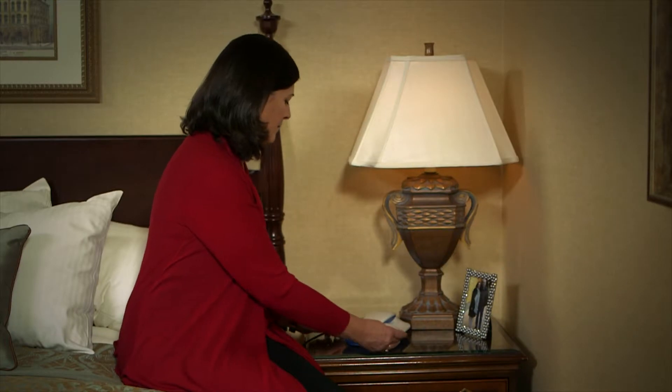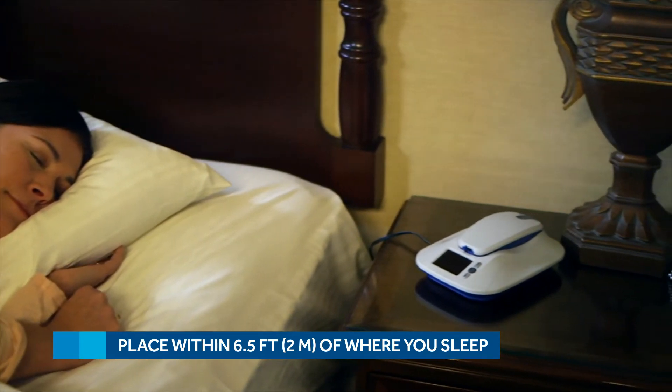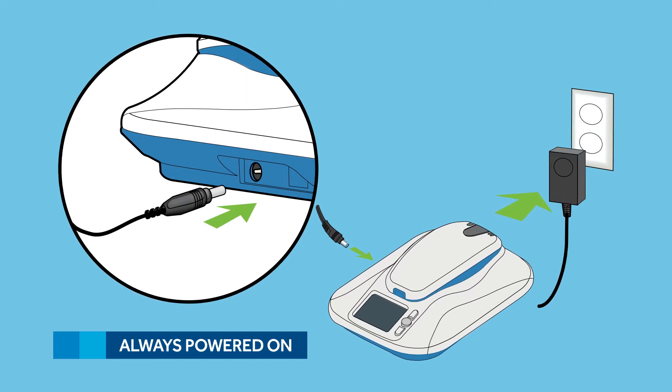First, find a good place to keep the MyCareLink monitor. It should be placed within six and a half feet or two meters of your bed. This is because your doctor will program your RevealLink device to send information to the MyCareLink monitor at a time you're usually sleeping. Plug it into a standard power outlet, and make sure it's one that receives constant power.